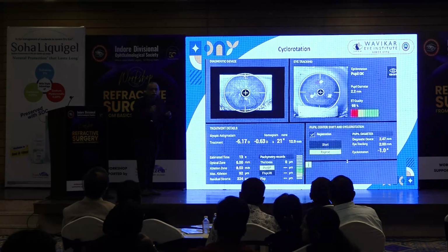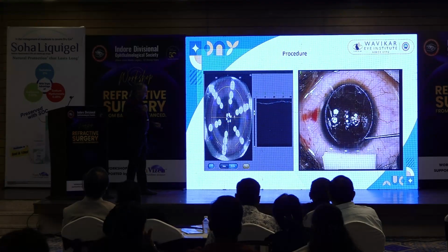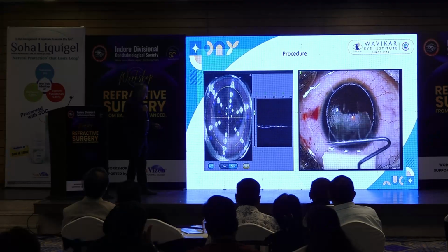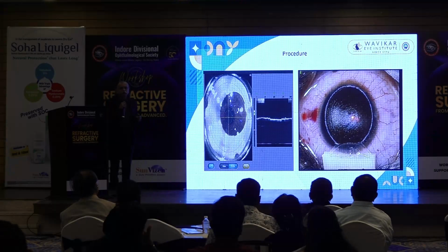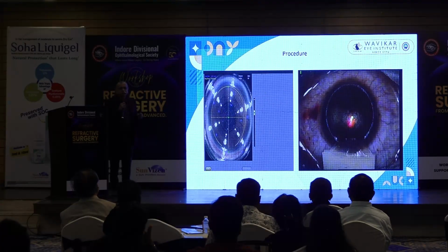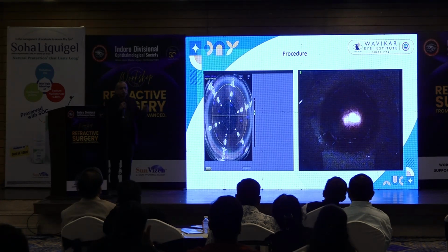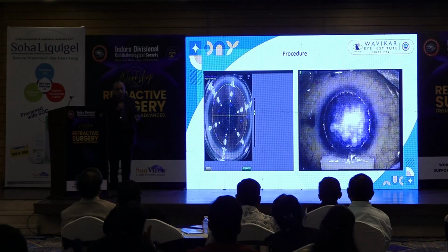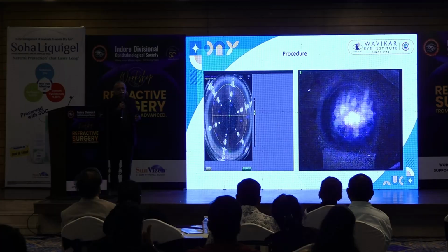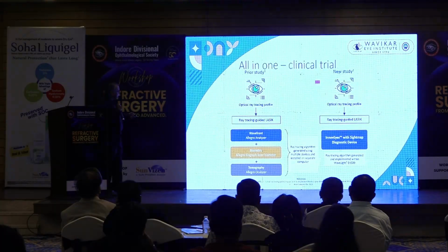And then this slide was shown, cyclorotation registration, very, very important. The most important thing is, as we keep on going with higher types of LASIK, is doing absolutely flawless LASIK. There is no place for microstriae, slight displacement of the flap, regular wetness or dryness of the bed as we start the treatment, because these are all contributing to our problems, and therefore flawless LASIK is a must.